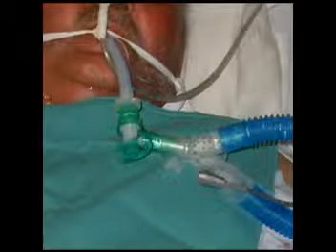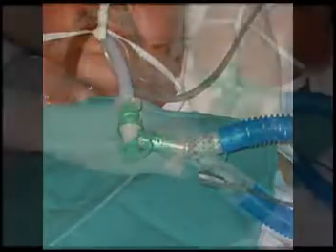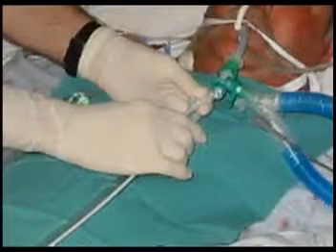Now it's time to place your bronchoadapter on. Again, this is a swivel adapter, which you've probably seen many times, and you'll place it right on the ET tube. You're going to continue to ventilate the patient, and this allows you to do so. Cool. At this point, you're ready to insert the Combicath.